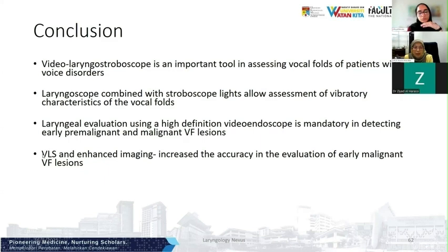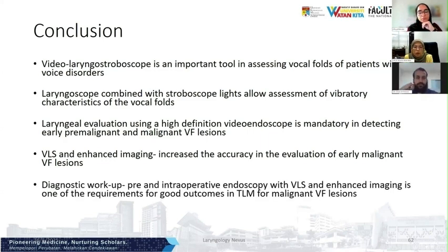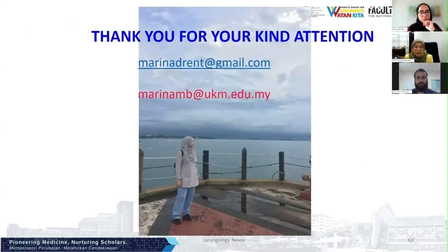If you combine video stroboscopy and enhanced imaging, it will increase the accuracy of the evaluation and detection of early malignant lesions, and will help you in diagnostic workup, pre and intraoperative endoscopy to map the tumor for you to get good outcomes.